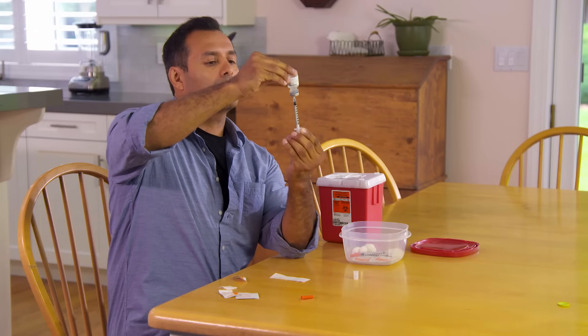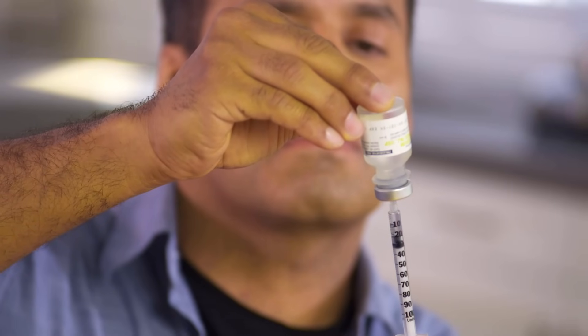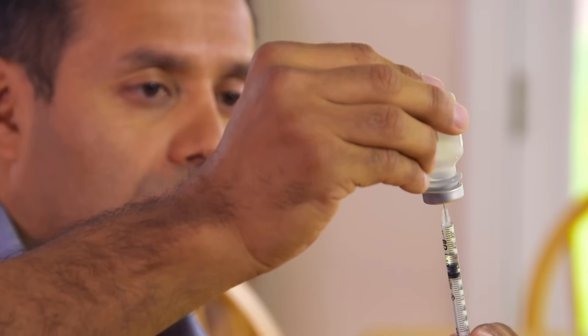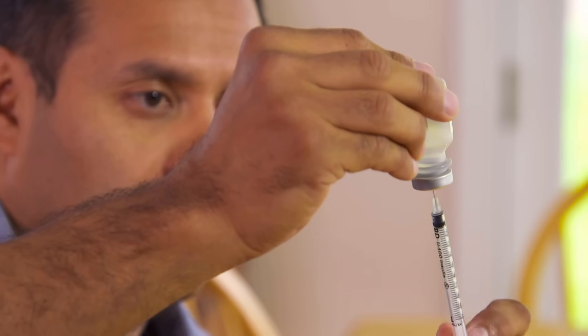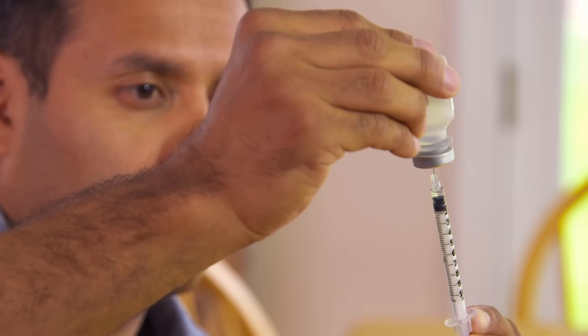Now slowly pull the plunger back down to the prescribed unit mark, making sure the needle is under the surface of the medicine. If you notice any large air bubbles in the barrel of the syringe, you need to remove them. Do this by pushing the plunger in again, sending the medicine back into the vial, then slowly draw the right amount out once more.